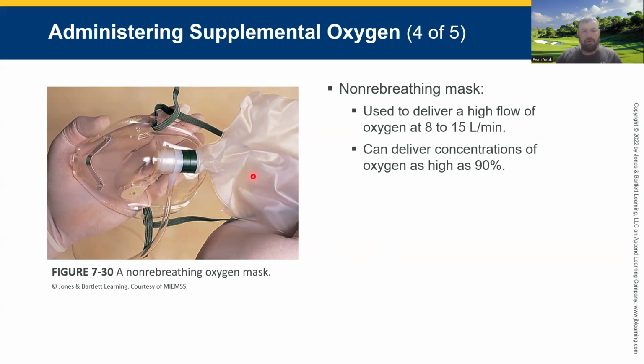They are able to breathe in oxygen from the reservoir bag. When they exhale, you'll see right here and right here are a couple little flaps. When they breathe in, those flaps seal, so they're getting straight oxygen. When they exhale, those flaps open up and let the carbon dioxide out, so we're not rebreathing carbon dioxide. We're getting oxygen in, and carbon dioxide getting out.